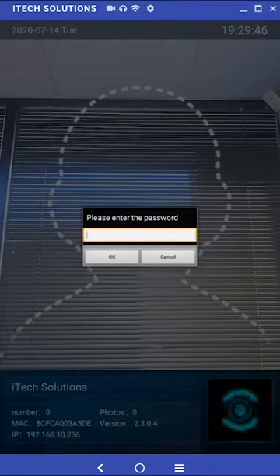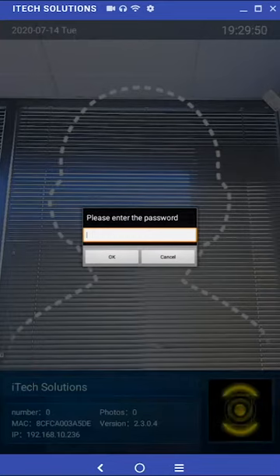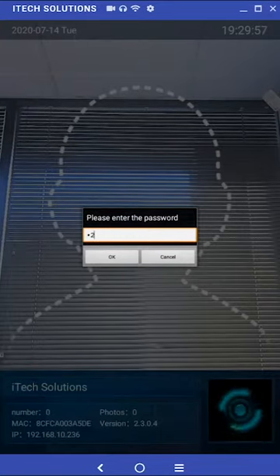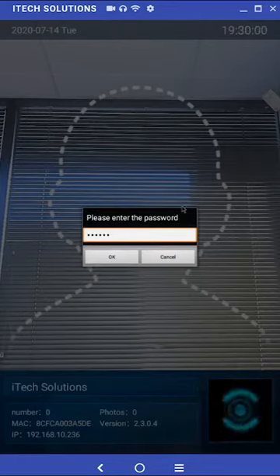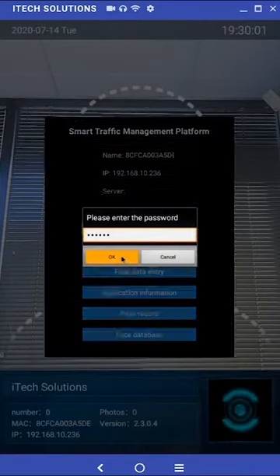It will prompt you for a password. The default password is one two three four five six. Then click OK.